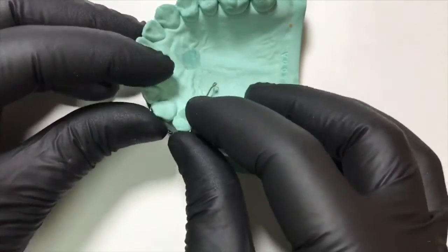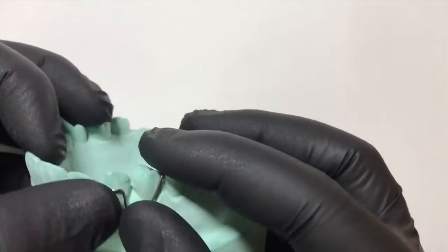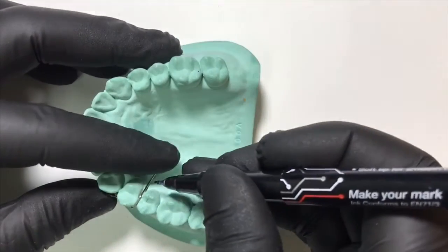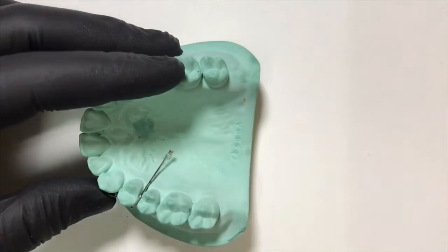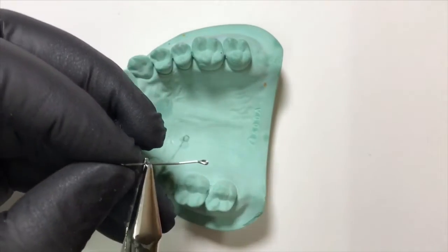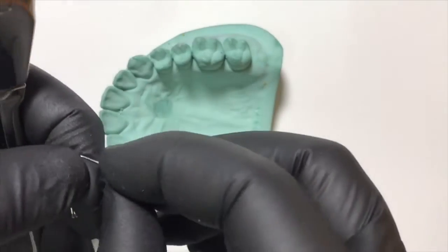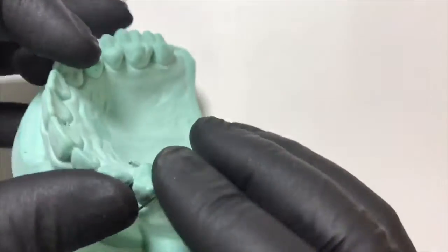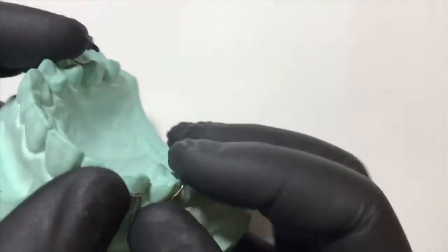We check its adaptation on the cast and do one more marking for a perfect palatal adaptation of the retentive arm. We engage this point in the beak of the plier and begin a bend. This bend helps in accurate adaptation to the palatal aspect of the canine retractor. The retentive arm is now perfectly adapted in the palatal aspect.